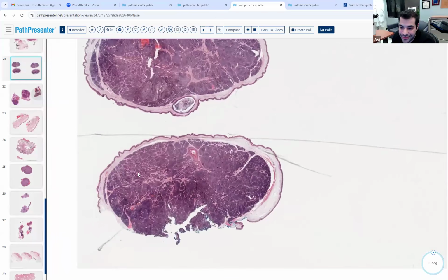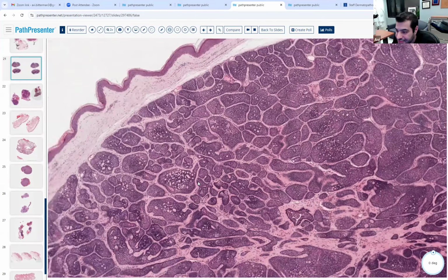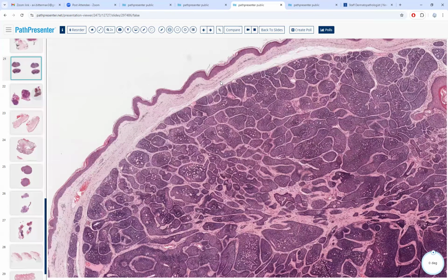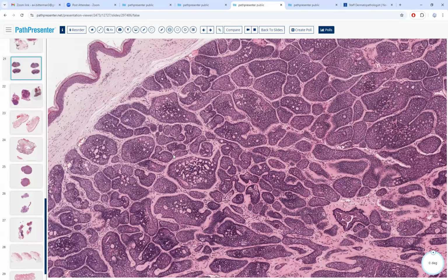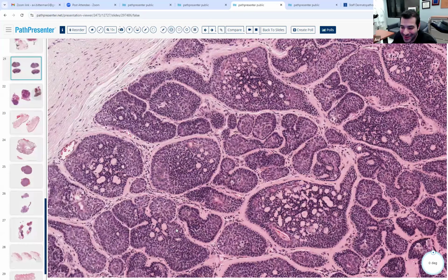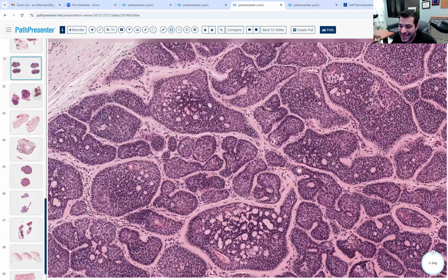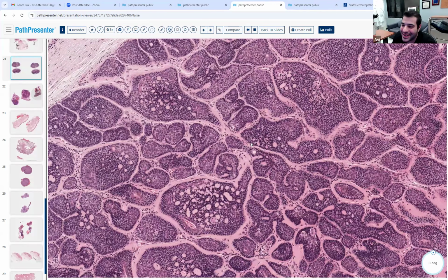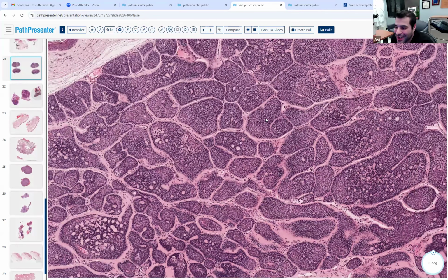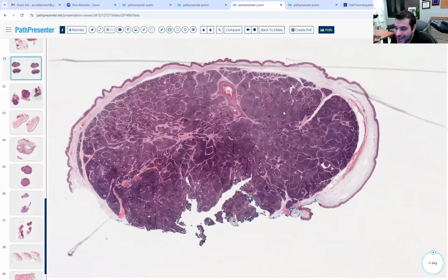So what would you call this one? This looks more like a cylindroma because it has this jigsaw in the eosinophilic basement membrane. Yeah, you see that hyalinized material. It's almost like someone took a pipette and pipetted a little bit of basement membrane into the tumor over here. Some have described this akin to the pattern you see on giraffe skin. Some have described this as a jigsaw, whatever's more helpful for you. But these tumors are really on a spectrum to each other.